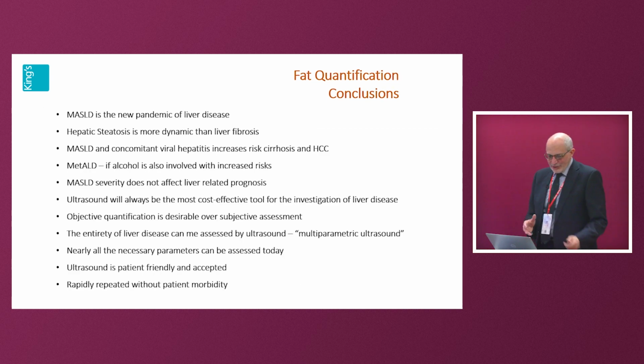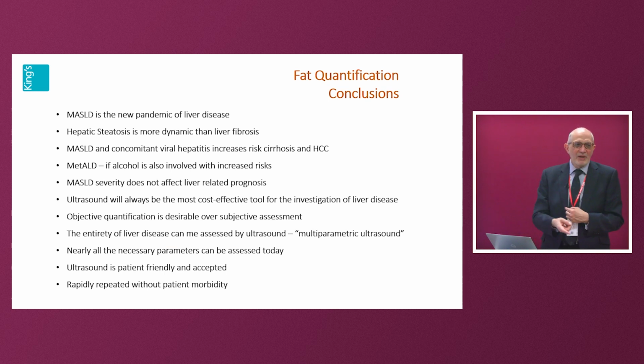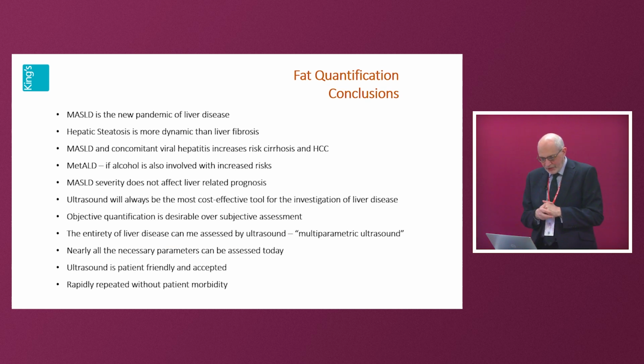So what's the conclusion? Well, it's the new pandemic of liver disease. It's more dynamic than fibrosis. Fibrosis probably just progresses all the time and is unlikely to regress. But hepatosteatosis can change during the week depending on what you're eating. So it's much more dynamic, and therefore you've got an imaging technique that's repeatable without any problem to the patient. It's going to increase as viral hepatitis decreases, and it's going to be the cause of more HCC.